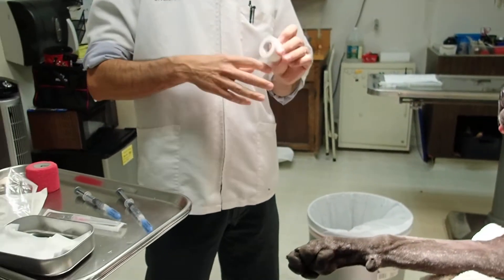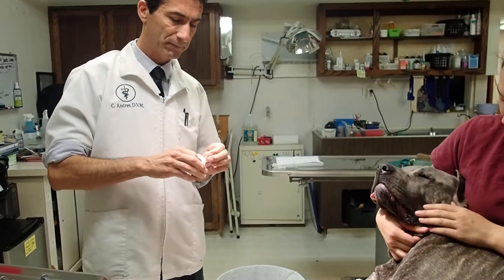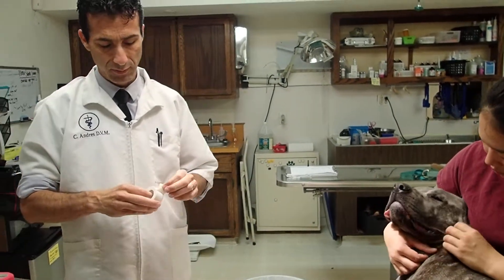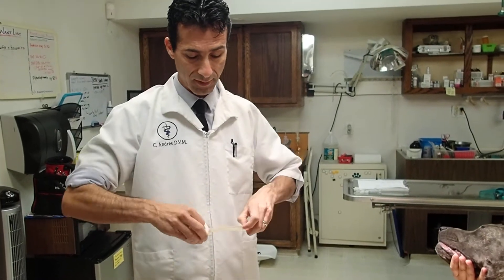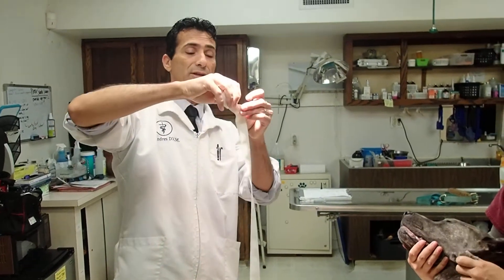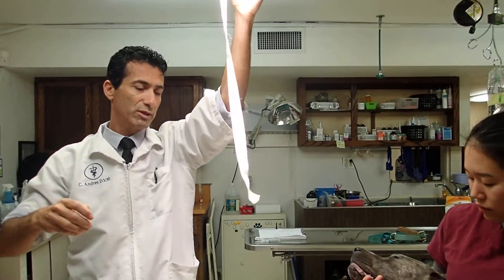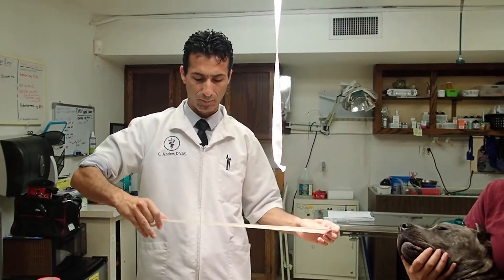The next thing I'm going to do mentally is go over the pieces of tape that I need. Every technician tapes catheters differently, every doctor tapes in catheters differently, but we're all aiming for the same goals — to do it as aseptically as possible using sterile technique. You could use gloves, and that would theoretically be the best way, but it is really difficult to deal with tape when you have gloves on, and most technicians and doctors aren't going to use gloves. I pull a strip out that's about two and a half times the circumference of the limb — I prefer to take more tape than less because I can always cut it shorter. I'll put it on my overhead light, which is a convenient place so it doesn't touch anything on the table or pick up hairs.